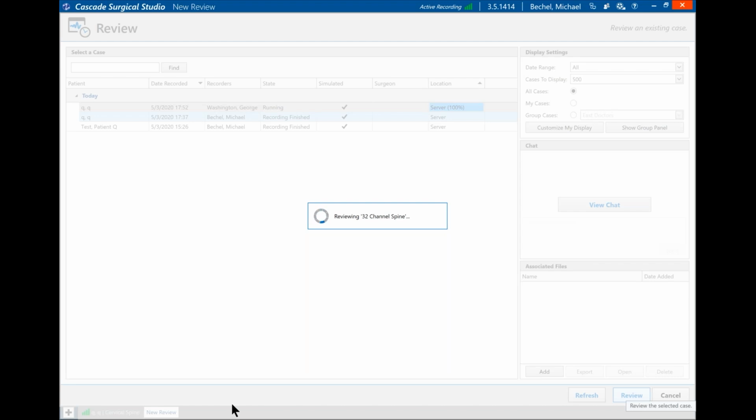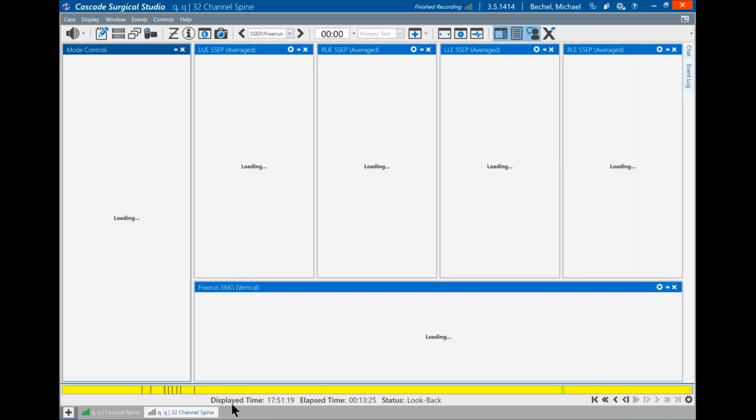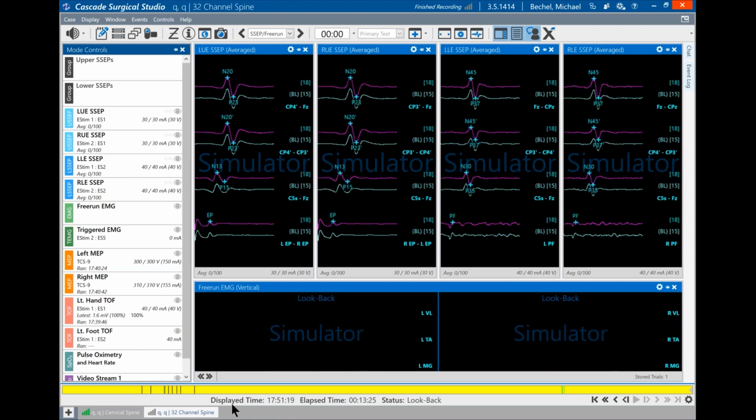Now, what else can it do? Well, it securely encrypts the data communication and storage. So the streaming data is automatically saved to the CADLink server. The data is collected offline and is automatically moved when the client, your system, reconnects to the CADLink network. Everything is HIPAA compliant and it does audit logging.